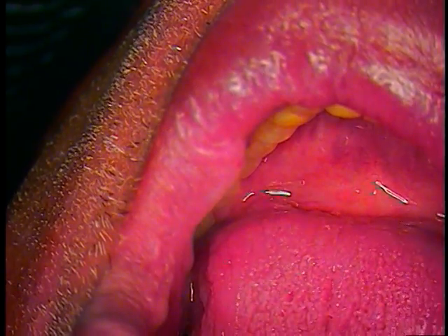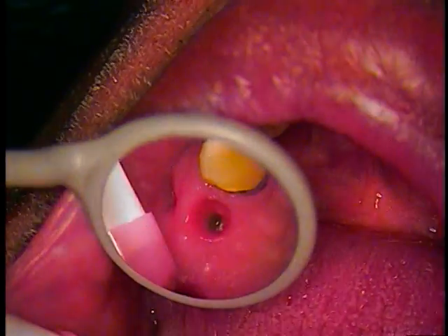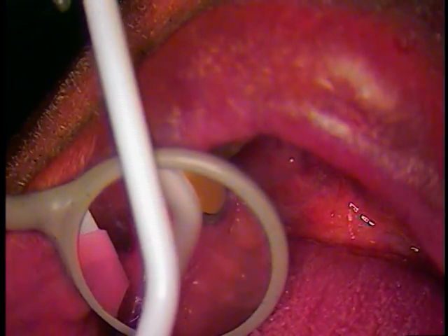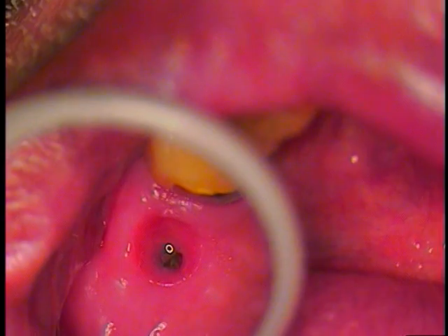Here's one. Here comes number two. Always go in with cavity cleanser, and then immediately rinse that. You'll see the epithelial tissue from all the healing. All the way to the base — suction that all out, well past the threads.